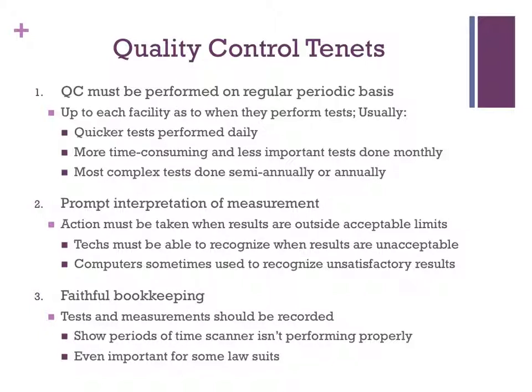The data from record books have also come in handy in order to defend lawsuits that may arise from the reading of a CT image. So for example, if the CT scanner can be removed as a source of blame for a misinterpretation or misdiagnosis, because it will prove the scanner was performing optimally and wouldn't have produced a subquality image that may have caused a misreading, then that can take the CT scanner out of the equation for the blame.